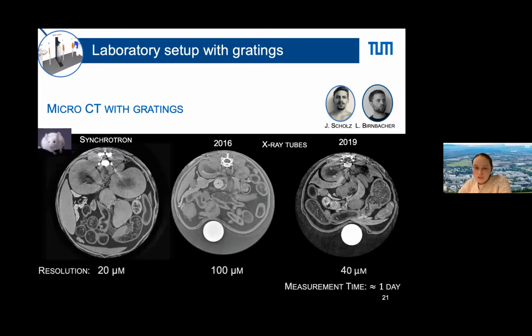I think the question to answer for the polychromatic case is more complicated, because it strongly depends on what you set up. The periods matter, whether you go to smaller or larger periods, which Talbot distance you go to, and the detector efficiency. So how efficiently do you see the contributing energies, and do you also see the others? And the amount of your spectrum matters.